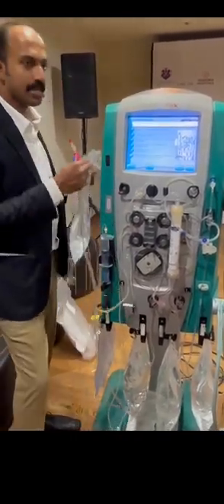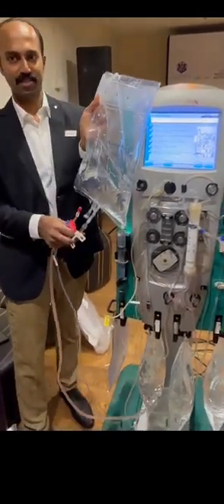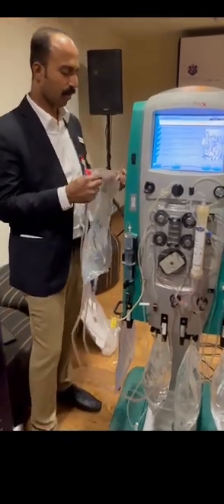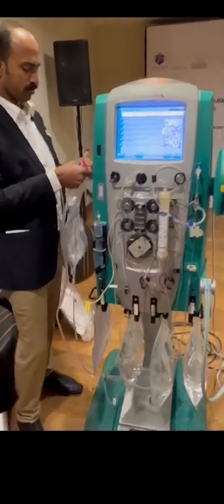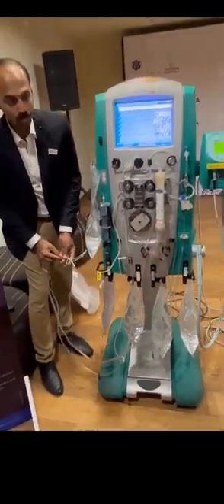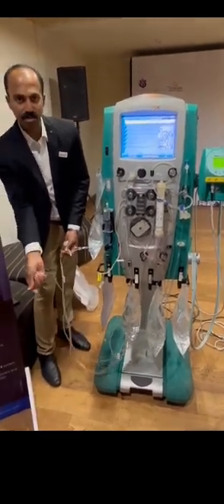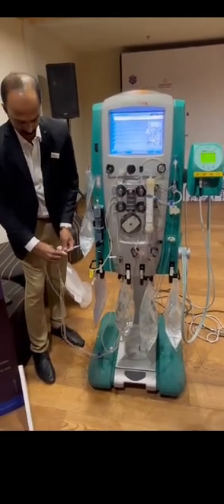So just consider this is our patient. Okay, the patient has two access lines, one arterial line and one venous line. I'm connecting these two. Just assume this is a patient access line. If you want to remove it, we can drain it. Otherwise, we can connect together. Okay, connected.